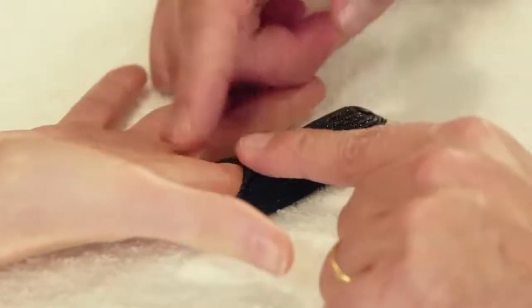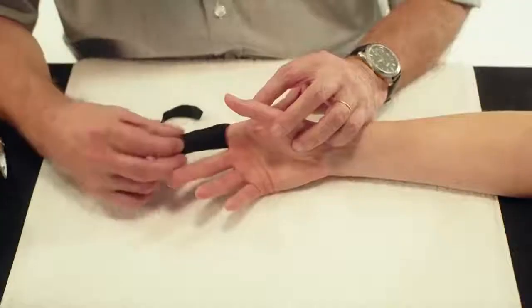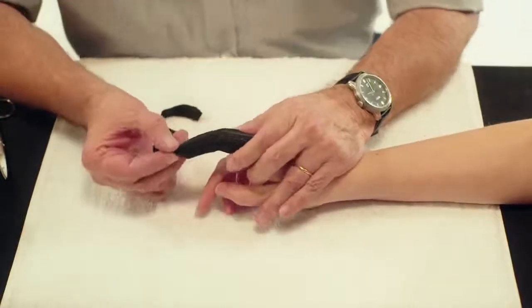This allows full finger flexion at the MCP joint. Position the finger in slight PIP flexion during the setting time.